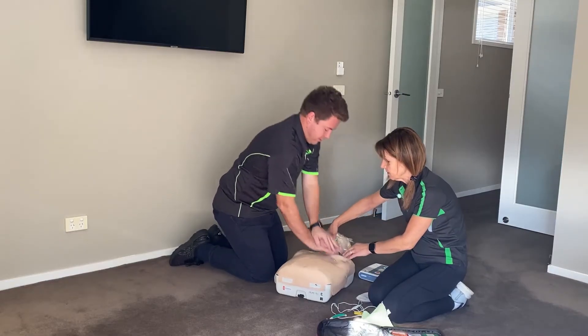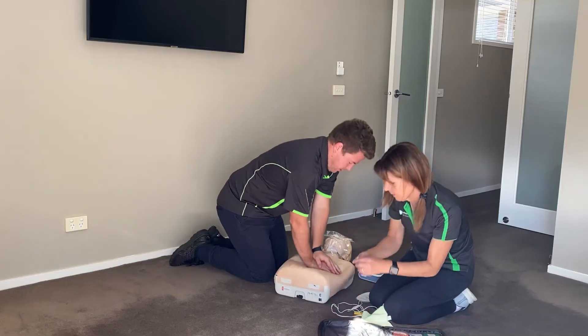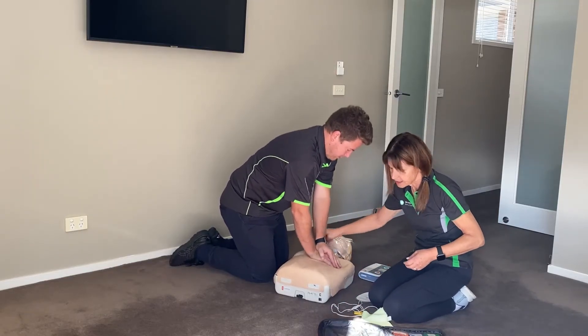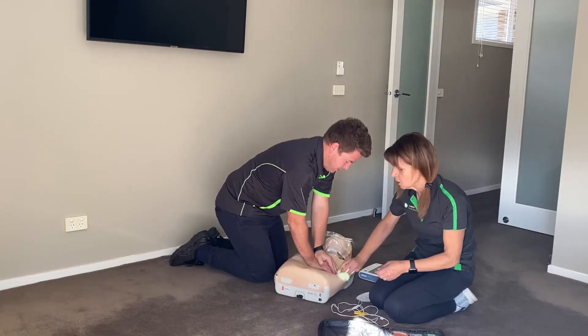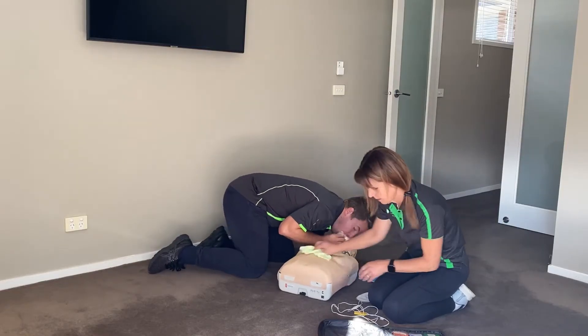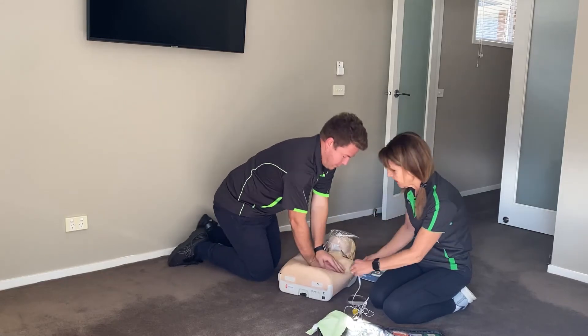Apply pads to the patient's bare chest. Plug in the pads connector next to the flashing light. Shave if it's an exceptionally hairy chest. Apply pads and plug in the connector. Dry off any excess moisture from the chest. Have a look at the pictures on the pads and place them exactly as stated.